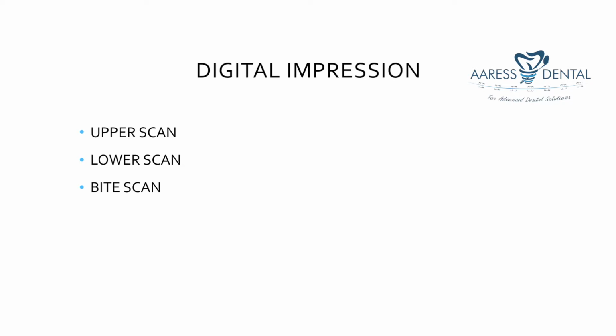What all do we do with the digital impression? We take an upper scan, we take a lower scan, and we do a bite scan. It is joining the upper and lower scan.